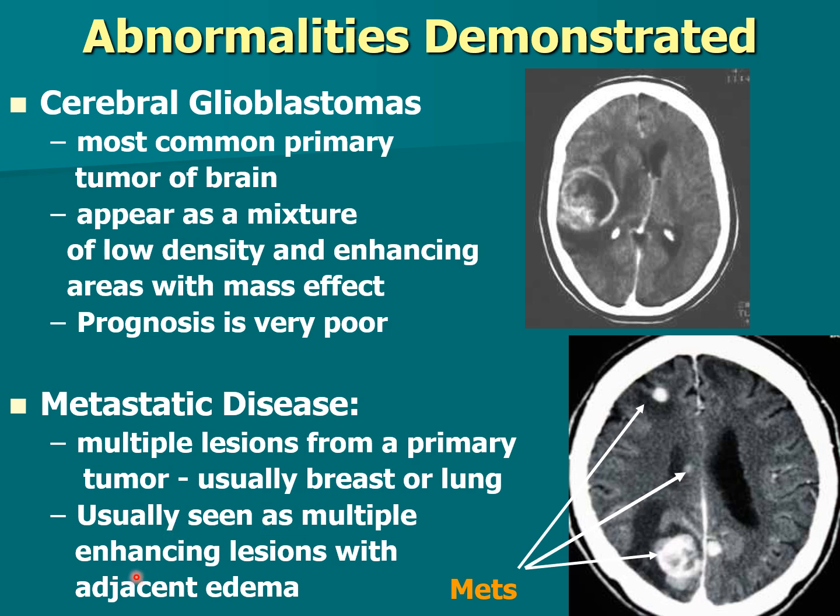Usually seen as multiple enhancing lesions with adjacent edema. So there's edema around that, but there's multiple ones. So that would be an indication that it's mets, and that it does enhance.